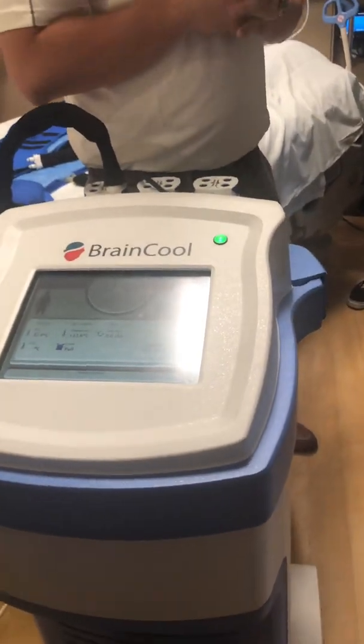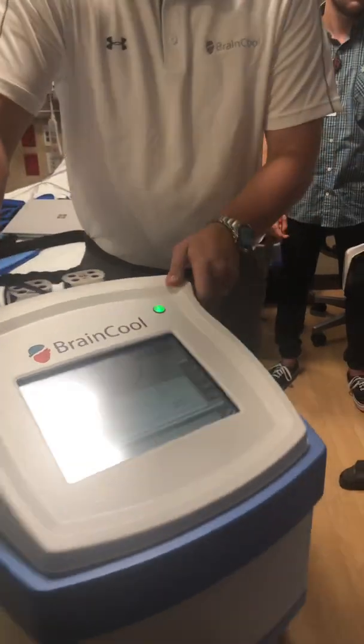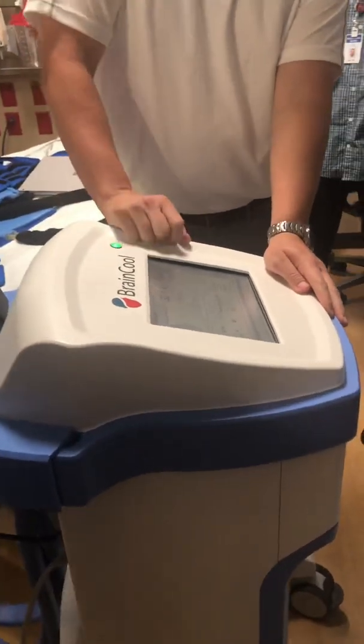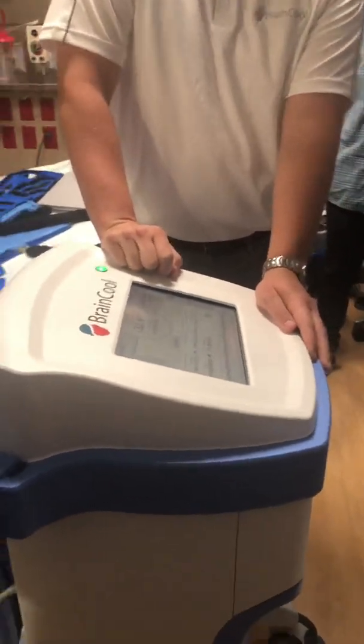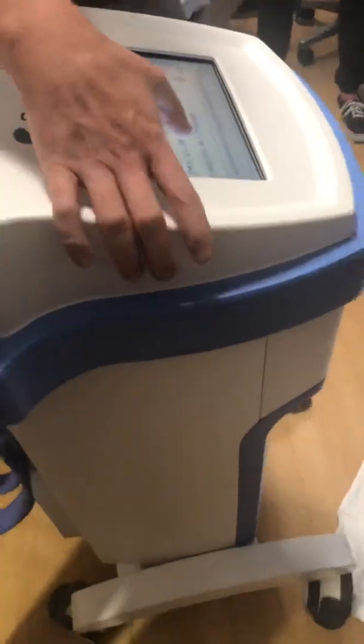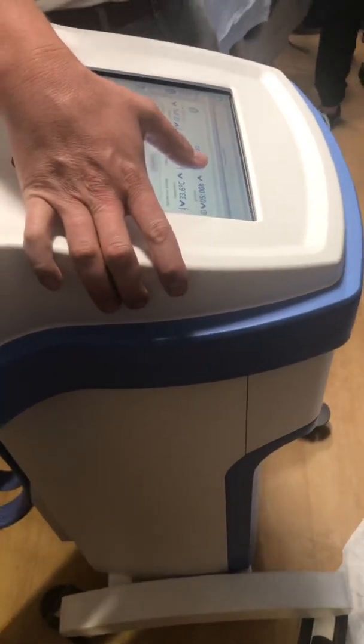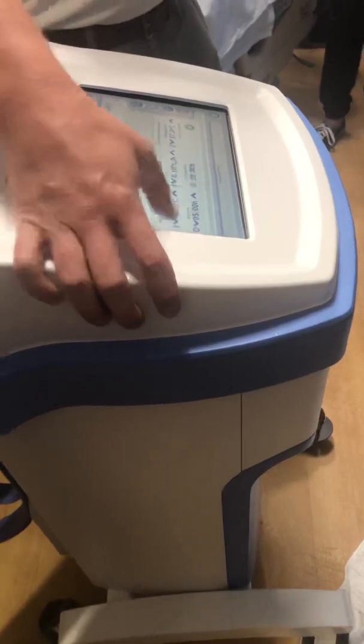I want to bring that up so you're not alarmed when you see that. Okay, so that's how you're going to toggle back and forth between the screen and so forth. Again, here are your settings. If the physician comes in and says, hey, they're not tolerating 33 very well, let's move it to 33.5 or whatever it is, you just make your changes right there.